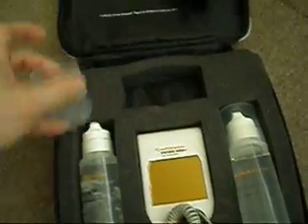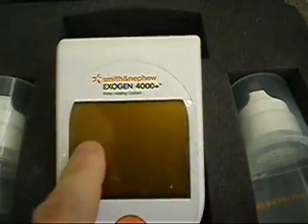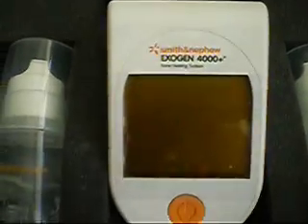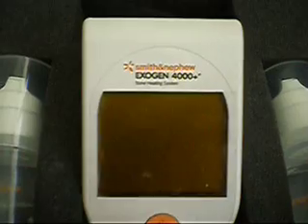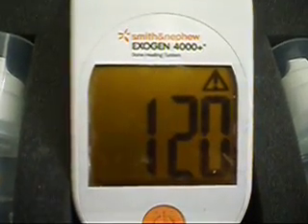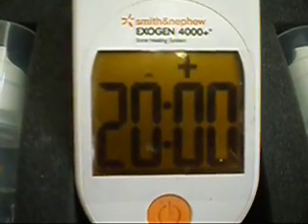Here is the unit itself, and I'm going to turn it on and demonstrate one thing for you. When you see a lot of sellers that have these, they will take a screenshot of the screen once they turn it on to indicate how many total uses it's had. I'm going to do the same thing in video form — press the button.